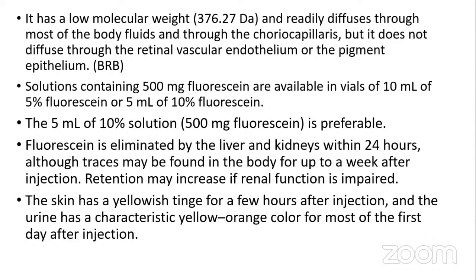If they are within the vessels, there's a characteristic fluorescence they should give you. So it's about dye being in the vessels, the blood retinal barriers, which is made up of the endothelium and the RPE, and then the fluorescent property of the dye, then time and pattern. Time is that the dye is meant to be at point A at this time.